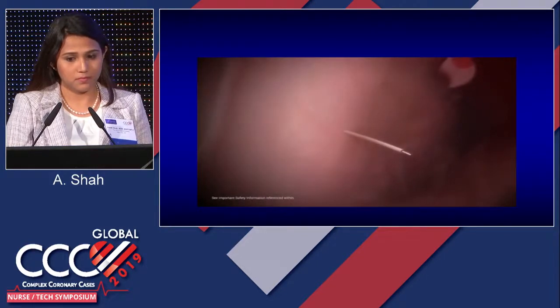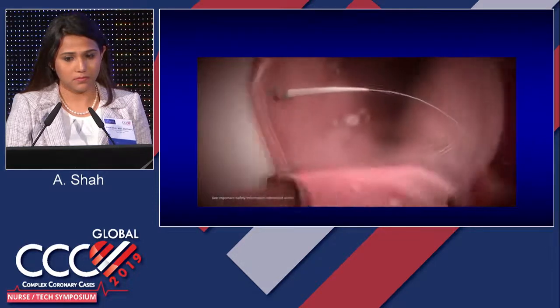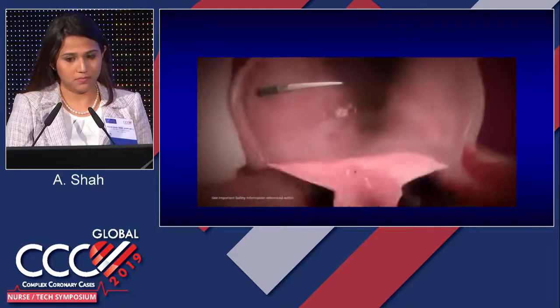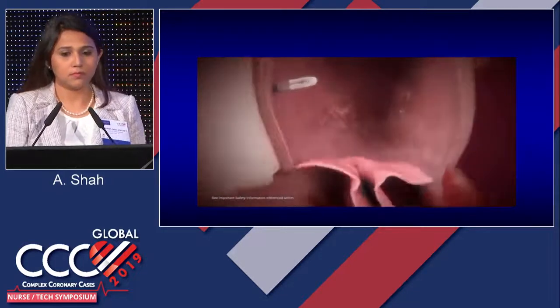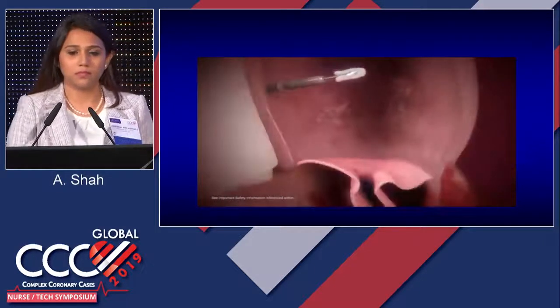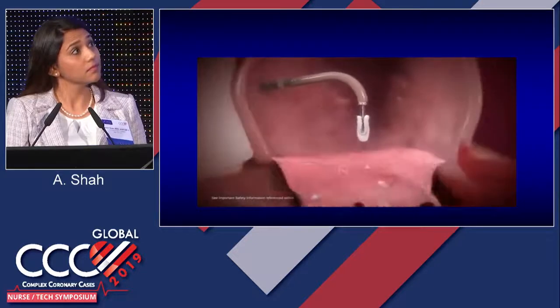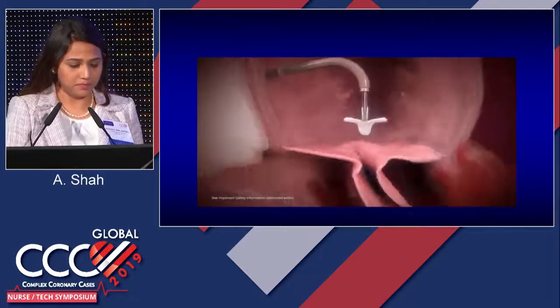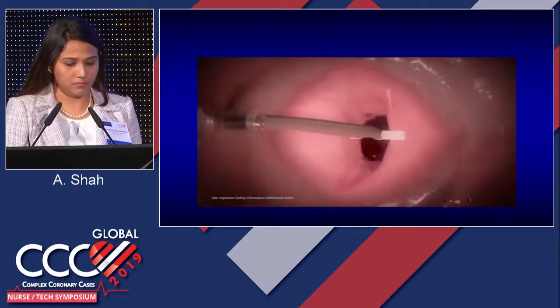MitraClip's steerable guide catheter is introduced over a previously placed guide wire. The dilator is used to gradually advance the guide into the left atrium, and the guide wire and dilator removed. The clip delivery system is advanced into the left atrium, positioning the clip above the regurgitant jet and perpendicular to the mitral valve plane. Inside the left atrium, the clip arms are open to 180 degrees and positioned perpendicular to the line of coaptation before crossing into the left ventricle.